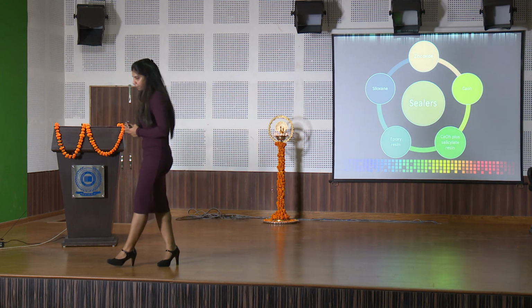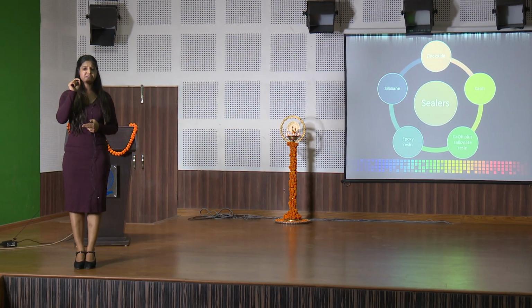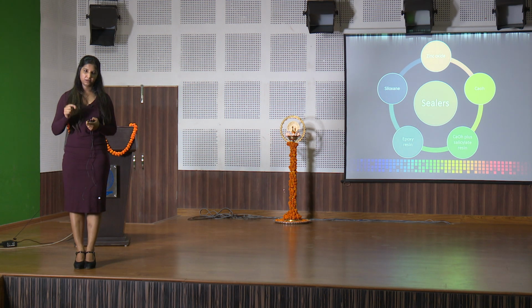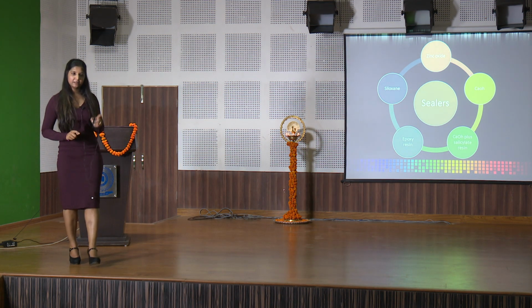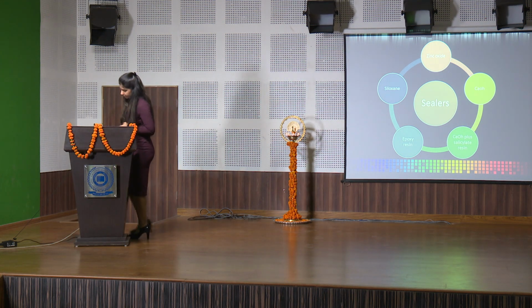Now it has been proved that even for resin based sealers to set, there should be some moisture in the canal. So I recommend, to save your time, save your money, and go ahead with the science, use only one paper point per canal. Put a paper point, let it be there for 1 minute, remove it, and that's enough. Even if the paper point is wet, this much moisture has to be there in the canal, and then you can use a resin based sealer.